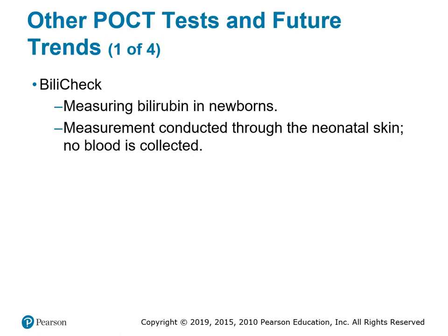All right, other POC tests and future trends. The BiliCheck measures bilirubin in newborns. Measurements are conducted through the neonatal skin. No blood is collected. I mean, that'll kind of work just like the vein identifier.